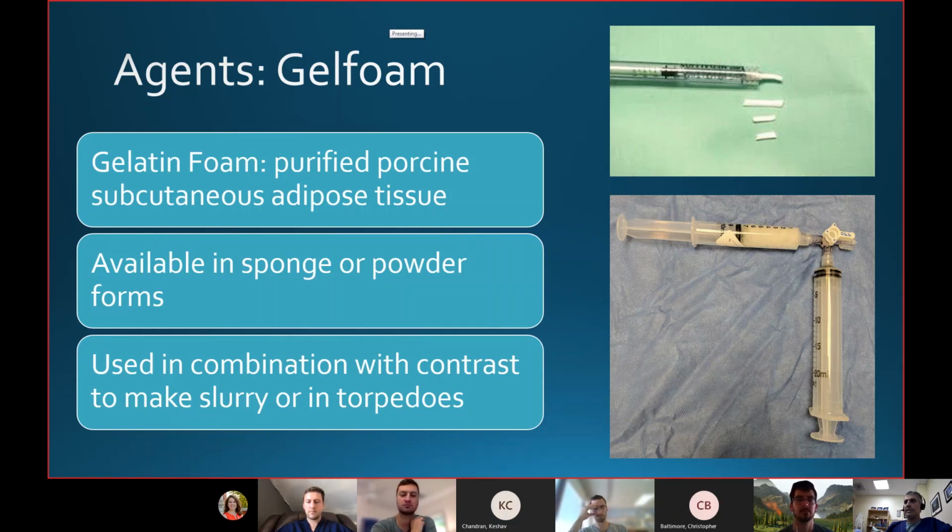That doesn't apply to everything. For example, if you put a bunch of gel foam into a renal artery, 2 weeks of ischemia is a very long time for a kidney, which can only take about 6 to 12 hours of ischemia. That could kill the kidney. The channels will recanalize, but your end organ would be toast. Now, if you have a trauma, for example, and you saw an active bleed on CTA, the patient was unstable, and it was in the gluteus muscle, that's a common site for people to have bleeding. It's a gluteal hematoma.